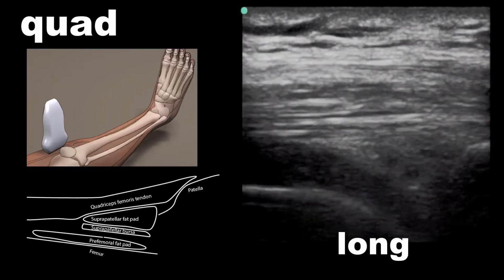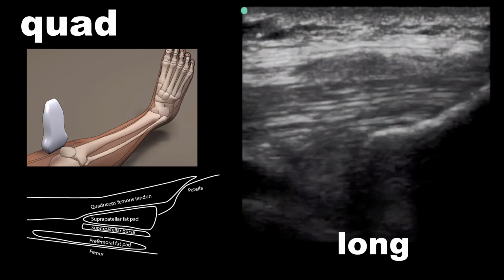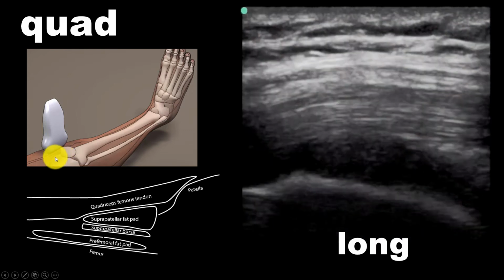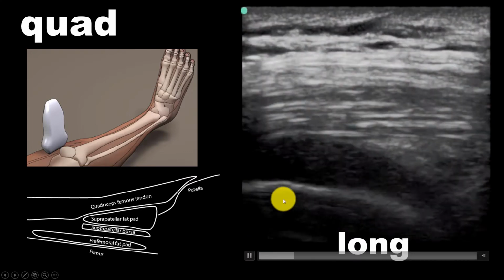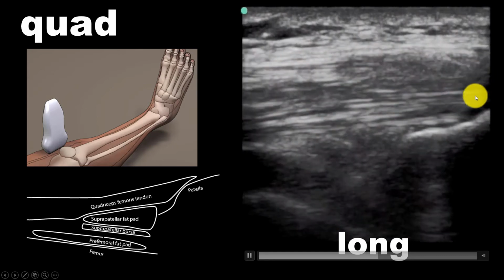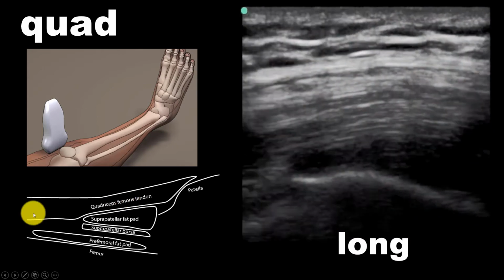We'll next talk about tendons. Here's an example of a quadriceps tendon. This is pretty easily obtained. You take the ultrasound probe, put it just above the patella, and then you scan upwards with the indicator towards their head. Tendons themselves are not quite as meaty as muscles, and they appear as these bright echogenic linear bands that can vary in thickness depending on the location.